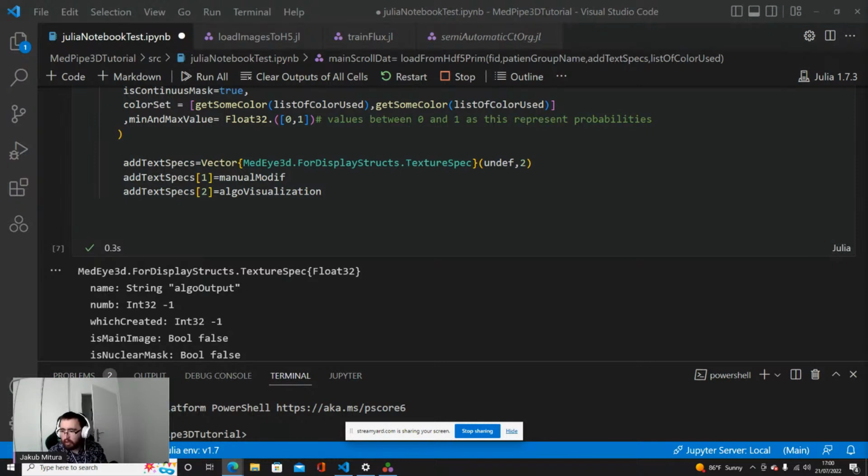Yes, so this contains the definitions. In theory, OpenGL should work on all of the platforms. Yes, but as you mentioned, it does not need to be true, as far as I see. And as I googled it, it seems that OpenGL can be installed on macOS. So I suppose you could try it. I hope it would help.